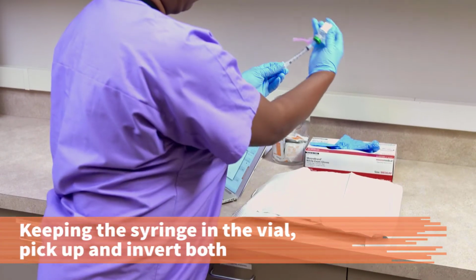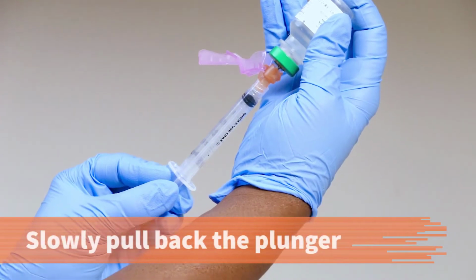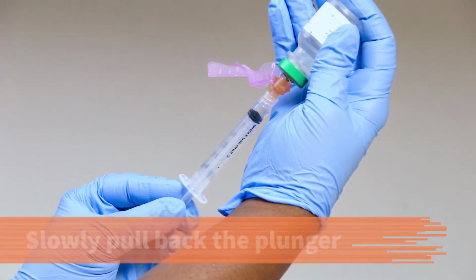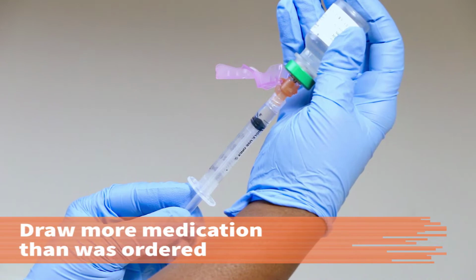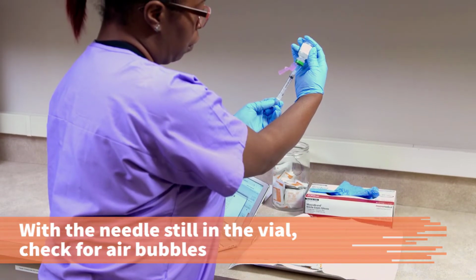Keeping the needle in the vial, pick up and invert them. Slowly pull back on the plunger with the unit at eye level and draw up more medication than ordered into the syringe unit. While the needle is still in the vial, check for air bubbles in the syringe.